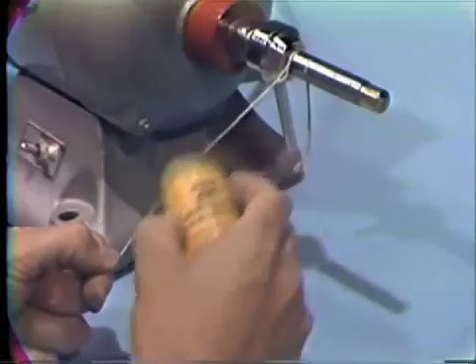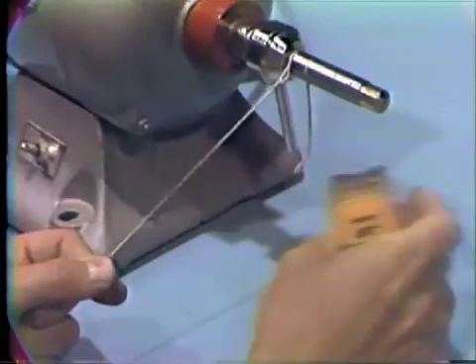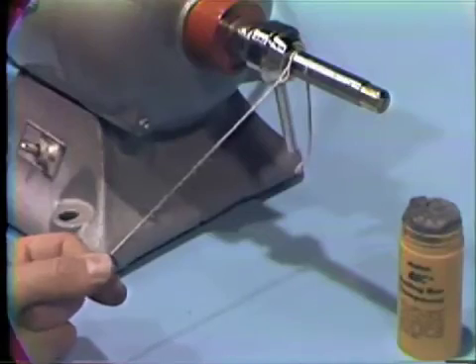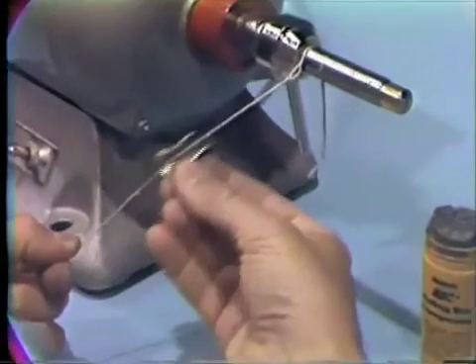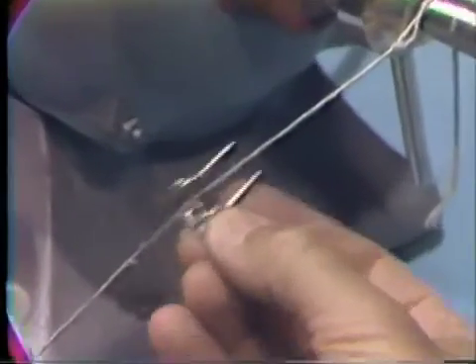Another technique for polishing the solder joint area is to use a string with BBC compound. The bridge is then rubbed against the string with the polishing compound to polish the connector area.